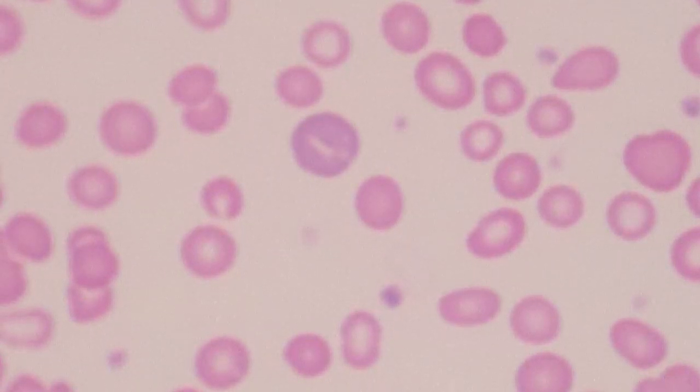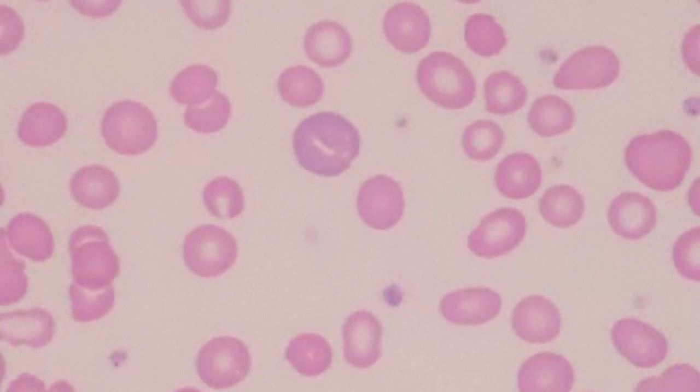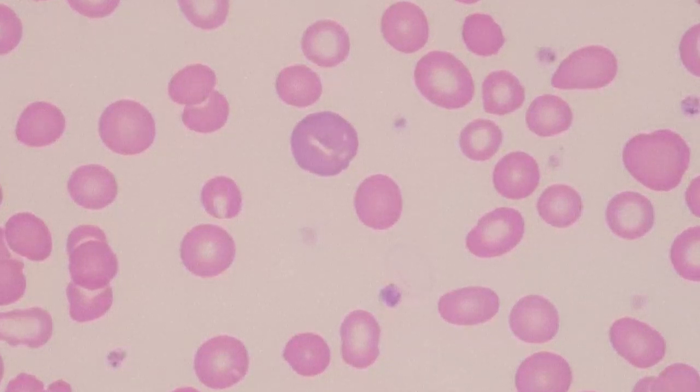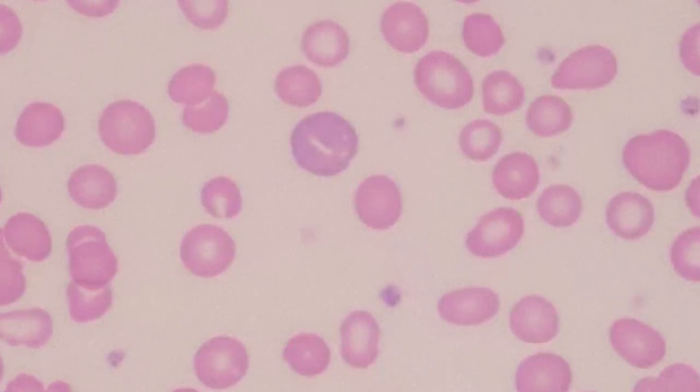So the instrument printout information it's going to give us related to that is the RDW, the red cell distribution width. And sure enough, on this patient, the RDW normally is like 11.5 to 15. And this patient has an RDW of 19. And that supports what I'm seeing here, because in the very center I see a big red cell, and then around it I see smaller ones. Therefore, I would probably call 2 plus anisocytosis on this particular slide.